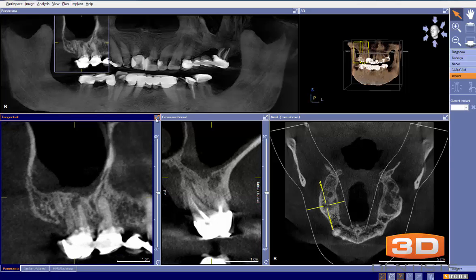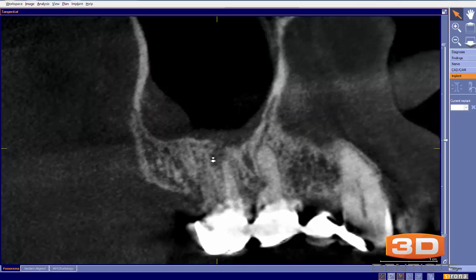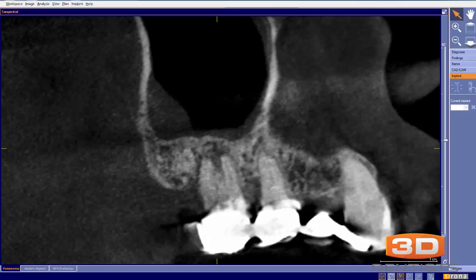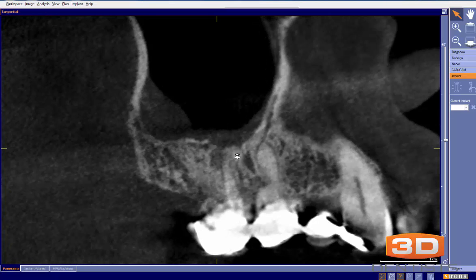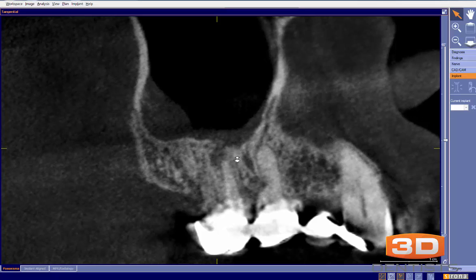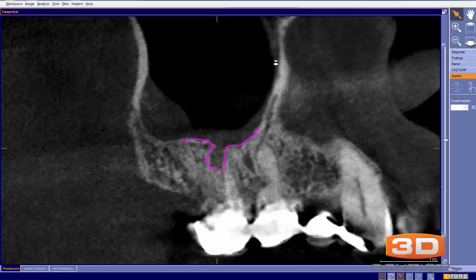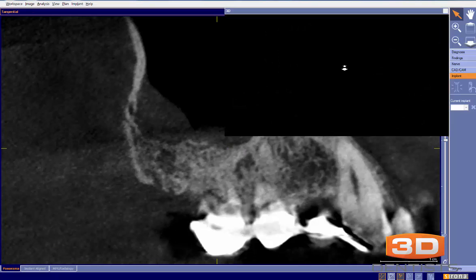Here in what I call the buccal-lingual view, or tangential view — as you take a look, you can see it does not communicate with the sinus initially, but as you go through, suddenly right there you can see a break in the sinus, just like that. I always want to keep an eye on these things.